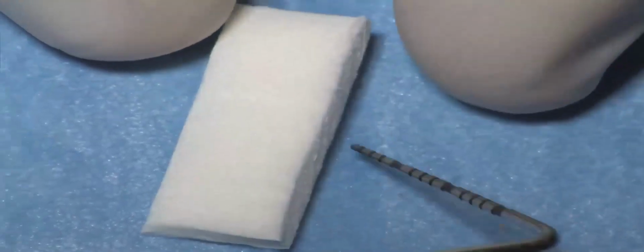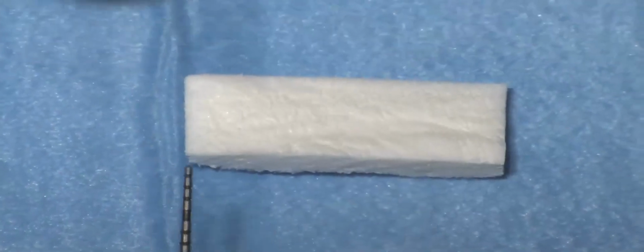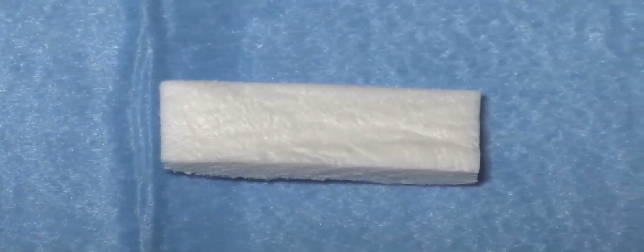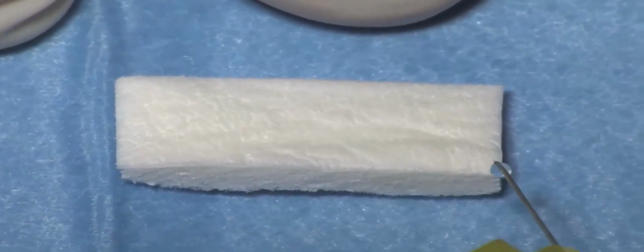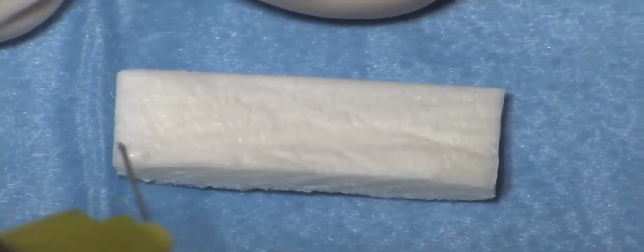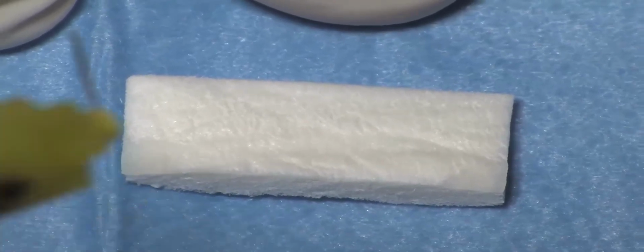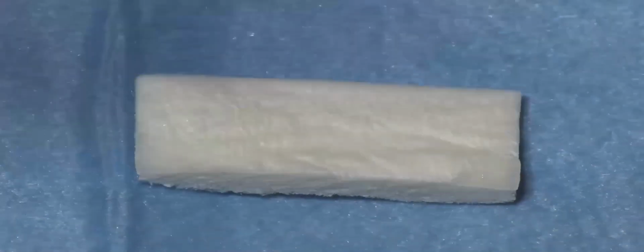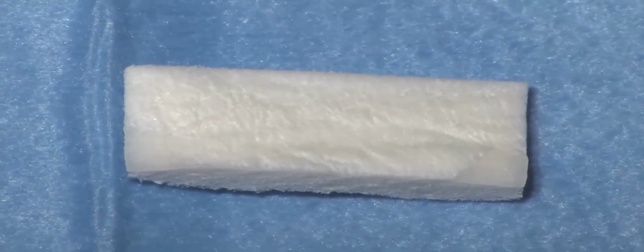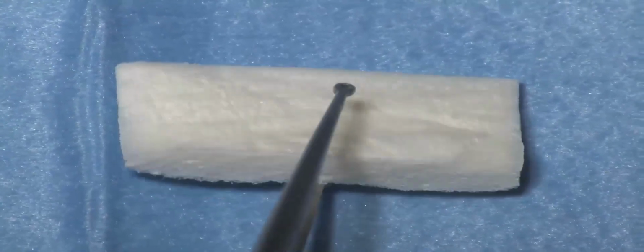So I prefer, this is in the area that has been to suture against the teeth. So to improve the stabilization of the material at the base of the papilla, I make only in the angles some hydratation in order to be able to suturing it better. Now we take the material with us.